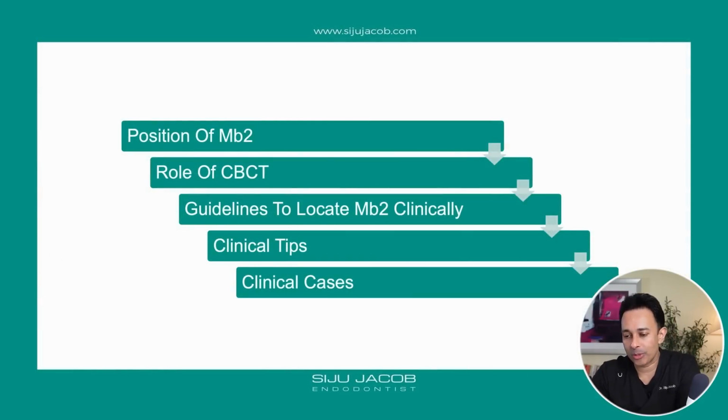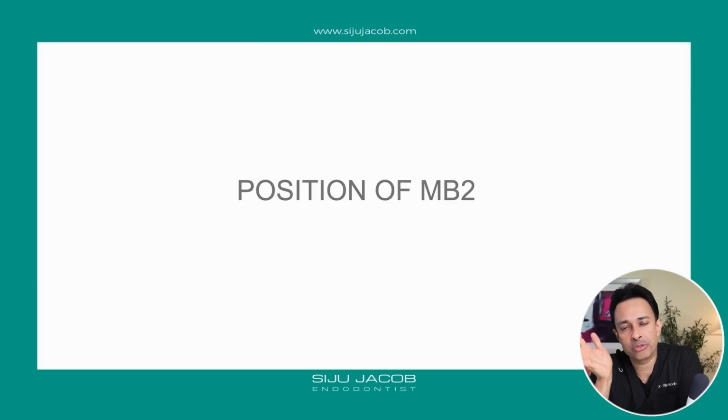We're going to talk about the common position, where exactly this MB2 is present most of the time, the role of CBCT, how it helps us locate the MB2, some guidelines to locate the MB2, some clinical tips, and also show you some of the clinical cases as we explain each of these along the way. So let's look at the position of the MB2. Where exactly do you find the MB2 most often in clinical practice?